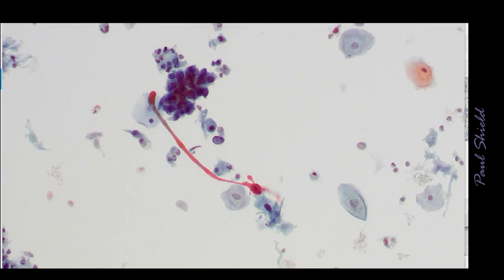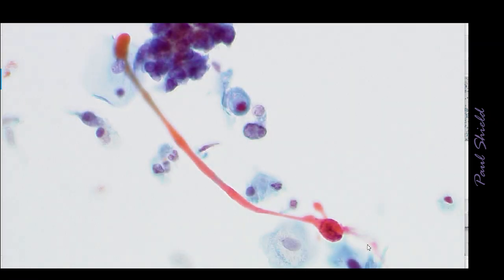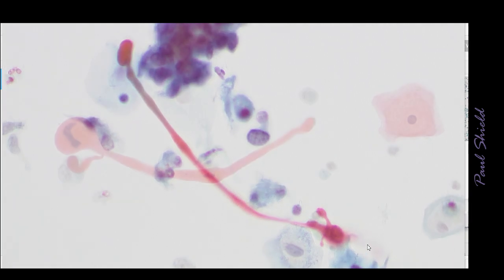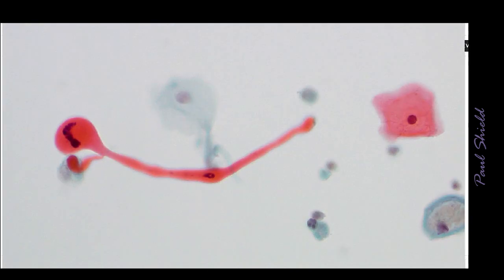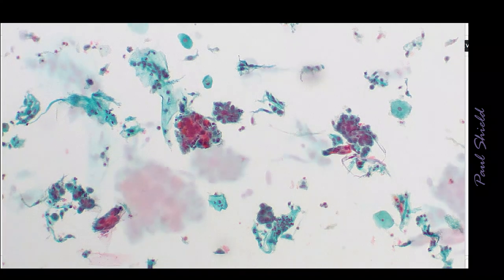Then pleomorphic cells that are orangiophilic and heavily keratinized, like this weird thing, are very common in well-differentiated areas of SCC. You can see this is staining intensely orange. Another one here, that's probably 2 cells that have that heavily keratinized cytoplasm.